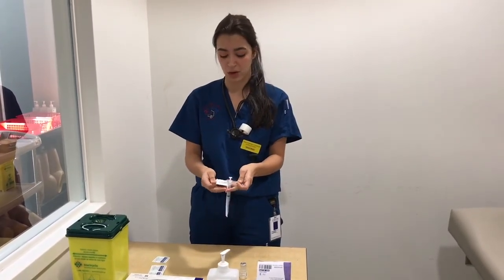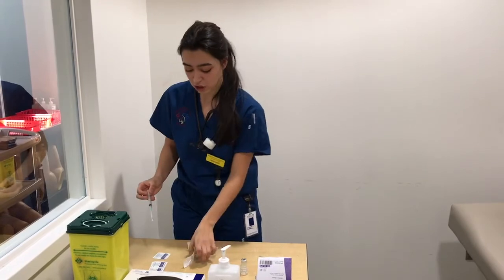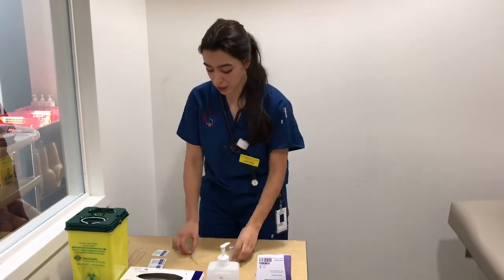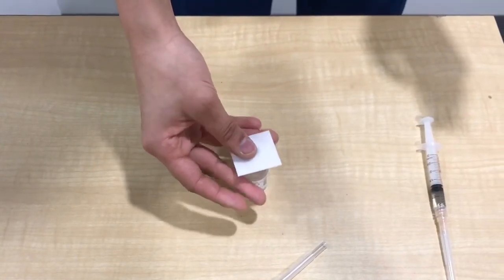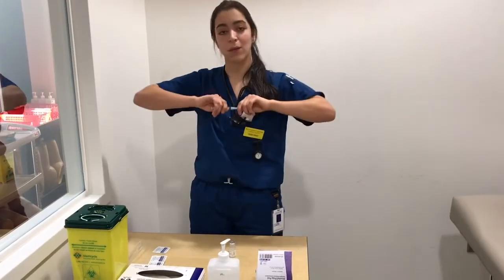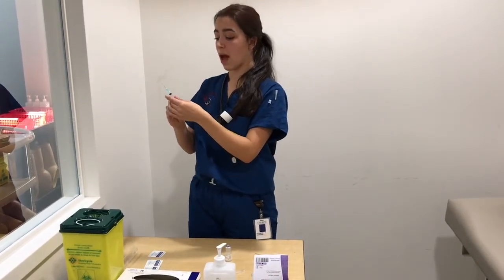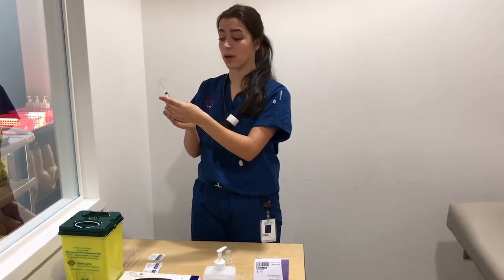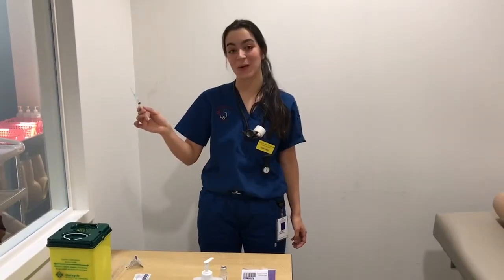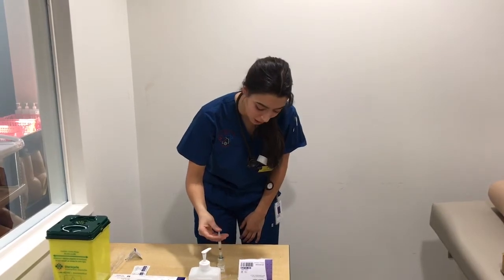So again, making sure that you're opening up the needle and you've performed your hand hygiene. And then also making sure that the package was not opened before. Next, make sure that you have the correct medication. I'll clean the top of the vial just to make sure that you're not transmitting any bacteria at all. Medication, opening up with your elbows at a 90-degree angle and pulling away from you. Again, we need 1 milliliter of the medication, so we are going to be drawing that medication amount up in air. So next what we're going to do is we're going to take the needle and push it down at a 90-degree angle into the vial and inject that air that we took up.